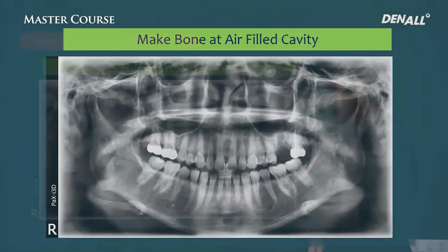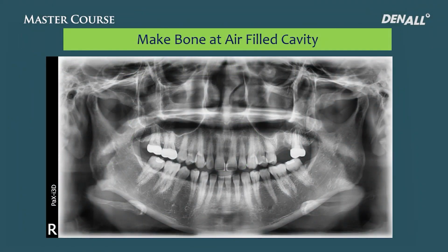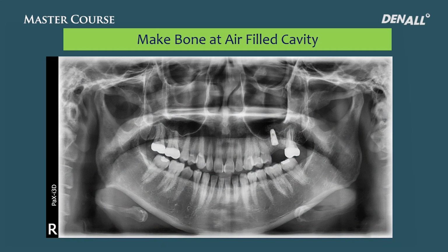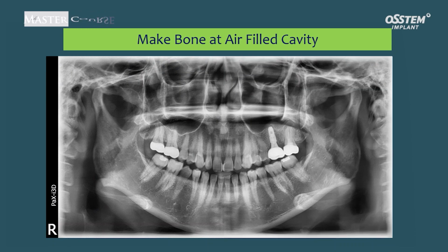Let me show you a different case. Extraction is done, and when implant is placed without penetrating, the sinus membrane is detached, bone graft is done, and implant is placed. After implant placement, loading is applied, and the sinus floor's outline is reformed within a sinus cavity. This is what we call sinus surgery.